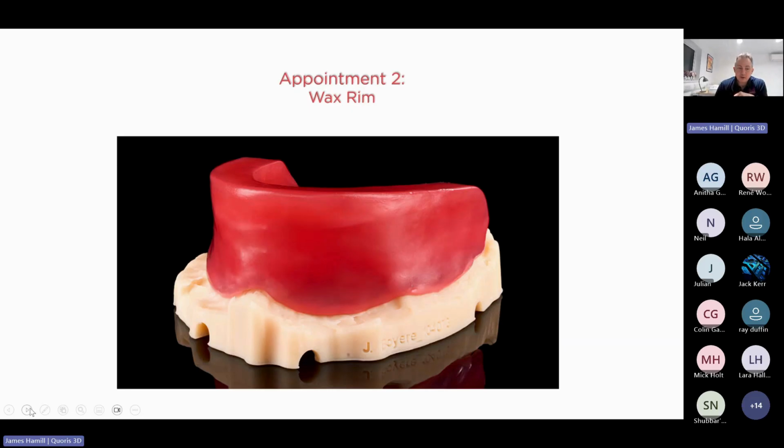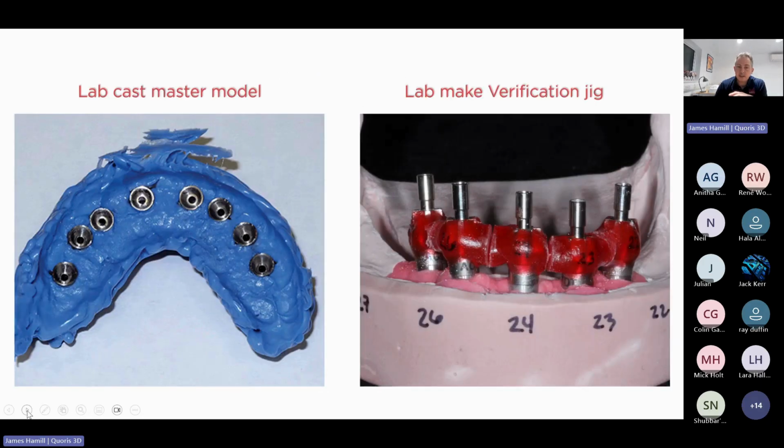And really, to be quite honest, an awful lot of dentists still work like this, and a lot of labs still work like this, sometimes in a little bit of combination with digital. Funny, I ran a course last week, and out of the 14 dentists there, only 2 were using digital workflows for their full arch restorations. So the stuff I'm showing is still very popular.